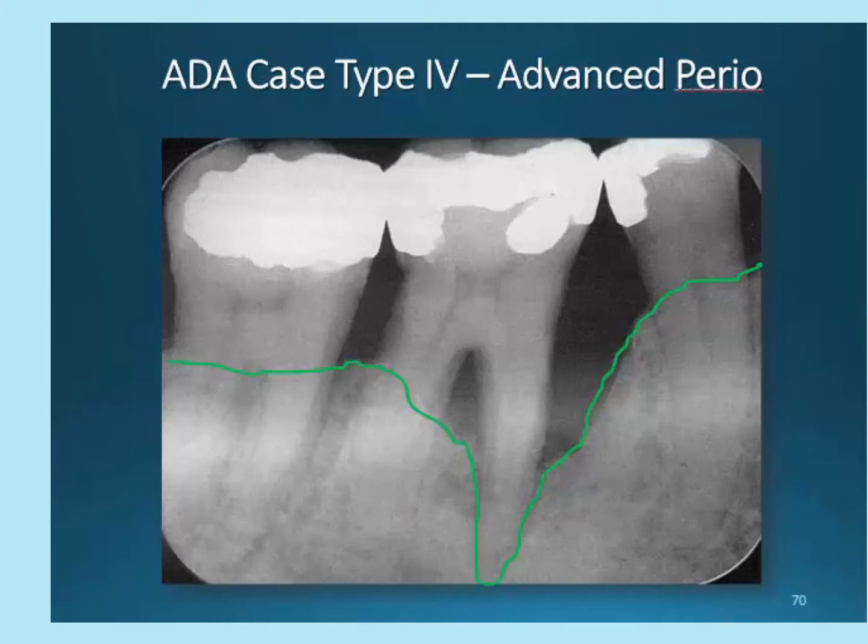Let's take a moment to view this slide. Notice I have drawn the bone loss to include the apex of this tooth. I did so that you would notice changes in the PDL that's involved. This tooth has little to no bone attachment on the distal root.